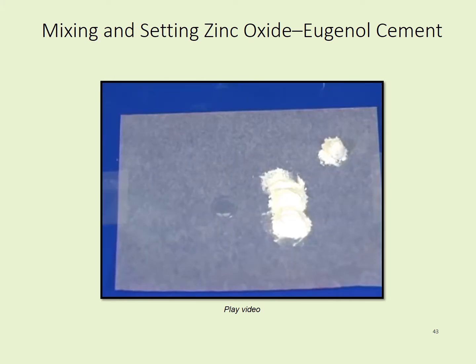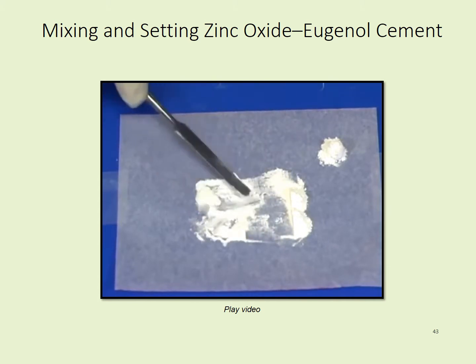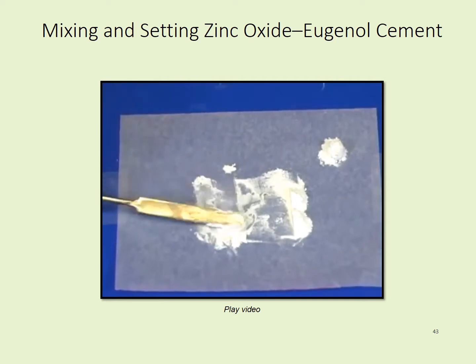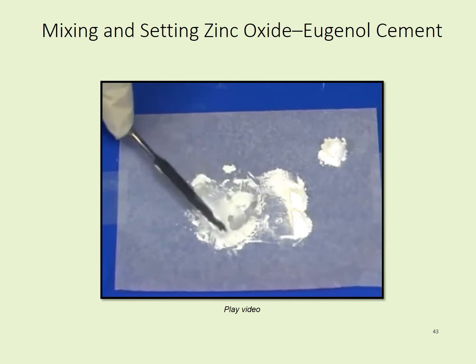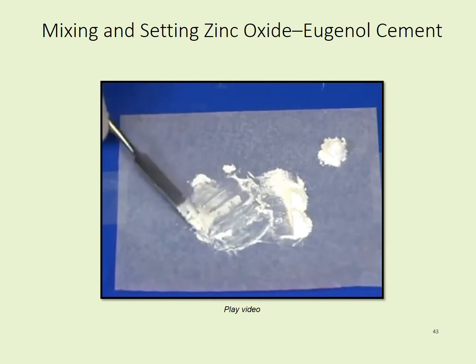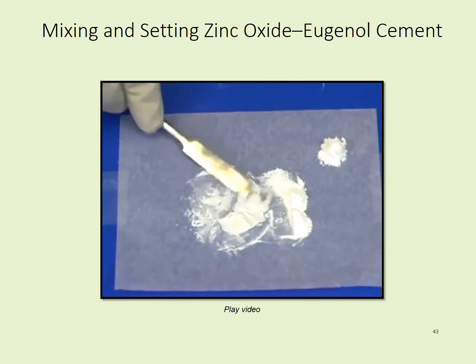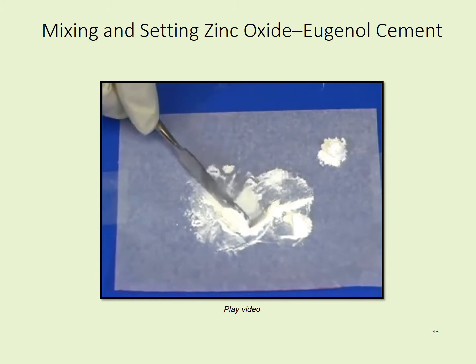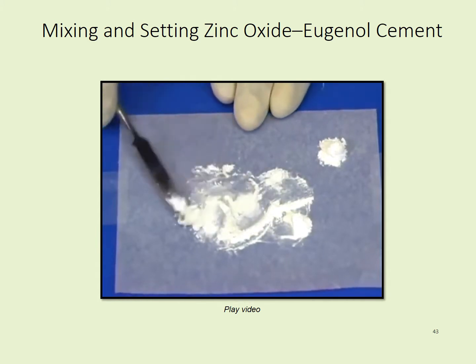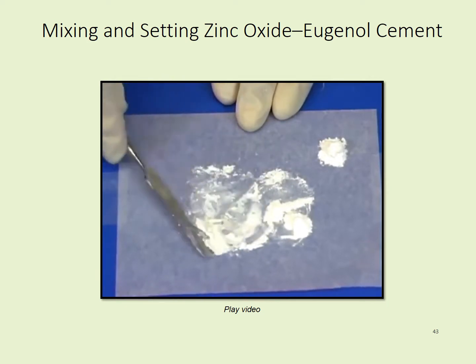To mix, incorporate half of the powder into the liquid and flatten firmly with the spatula. Apply heavy pressure to incorporate the powder. Incorporate some of the second half of the powder. Adding the powder quickly in 2 increments will make for a stronger mix.